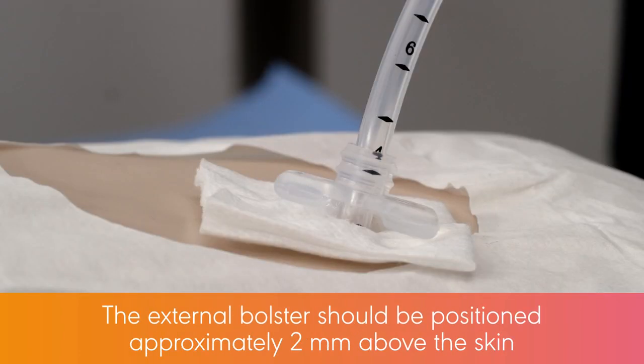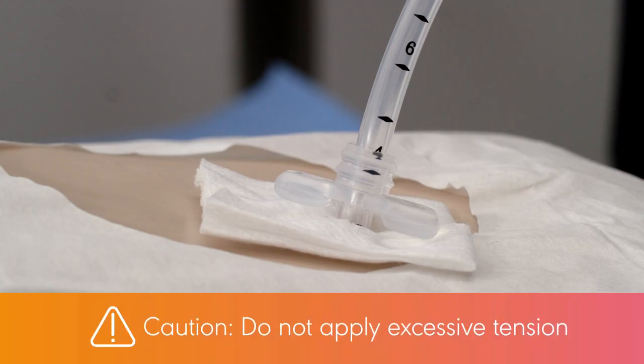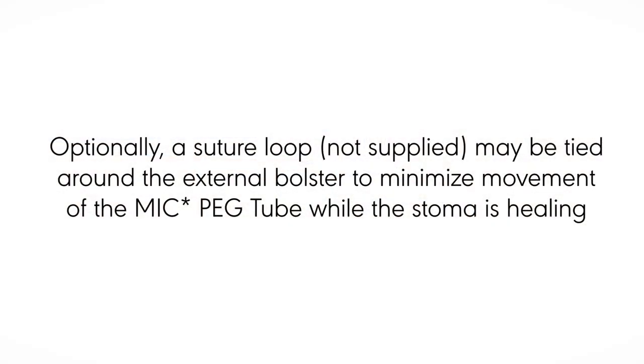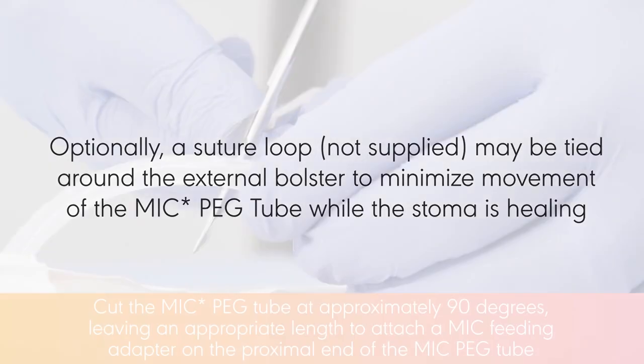The external bolster should be positioned approximately 2 millimeters above the skin. Caution: do not apply excessive tension. There should be no compression of the gastric mucosa or the skin. Optionally, a suture loop, not supplied, may be tied around the external bolster to minimize movement of the MIC-PEG tube while the stoma is healing.